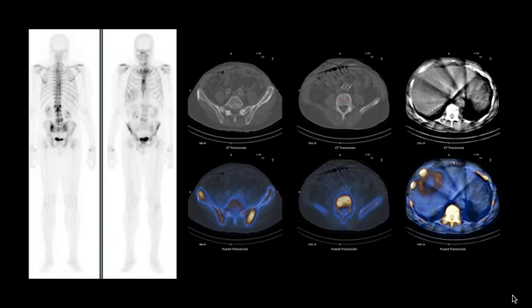The next case is of a patient with history of prostate cancer who presented with rising PSA and a whole body bone scan was performed. We are looking at whole body images in posterior and anterior projections. There are foci of increased uptake in the spine and the pelvis that suggest osteoblastic bone metastases. To further characterize these lesions, we did a SPECT CT.